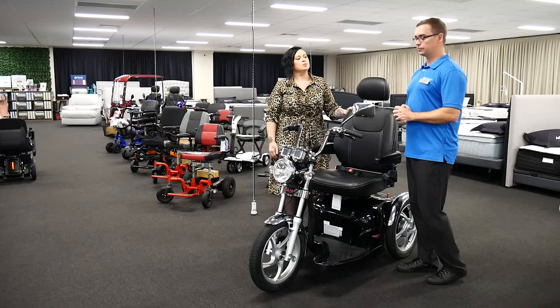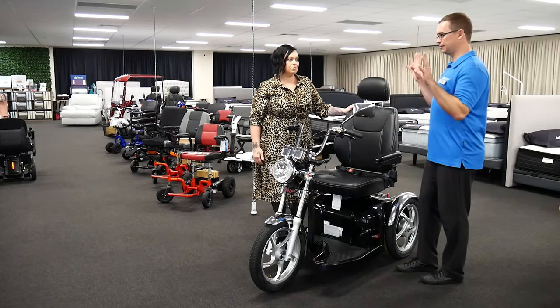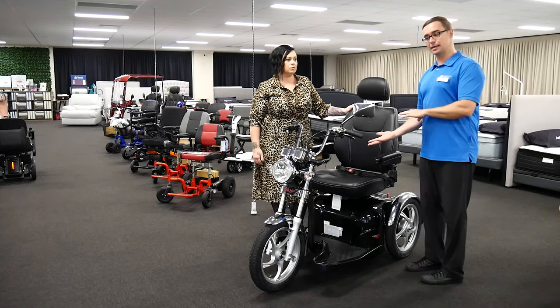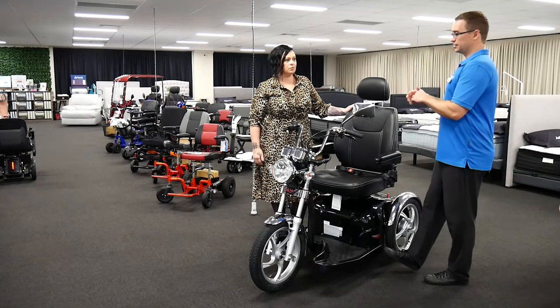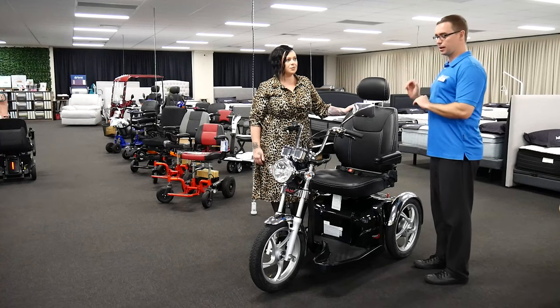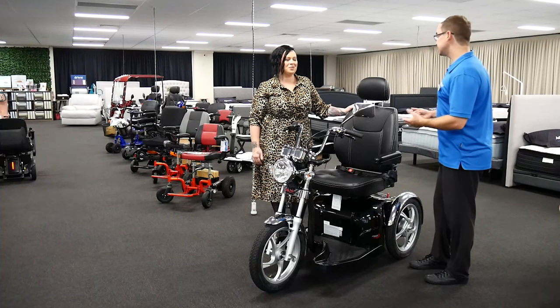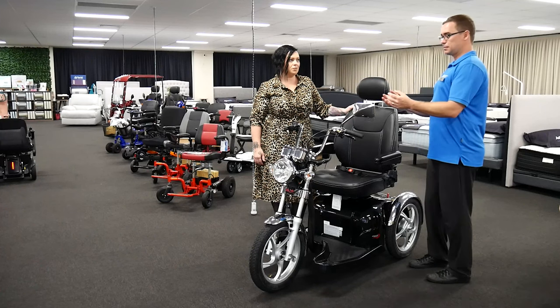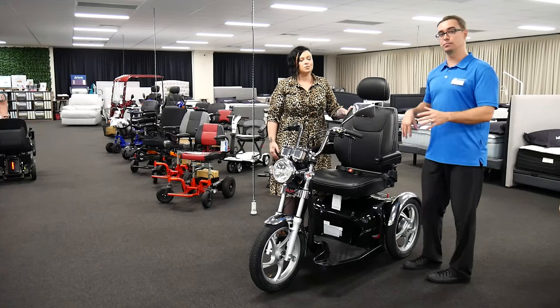Sort of how we've spoken in other videos about de-hospitalising, de-institutionalising the look of equipment — talking about that with beds, where people prescribed beds can feel they're a little bit too hospital in nature. We've got a range of other scooters behind us here, some looking a bit older in terms of how a younger generation may view them. So they may be more open to having this piece of equipment meet their mobility care needs.